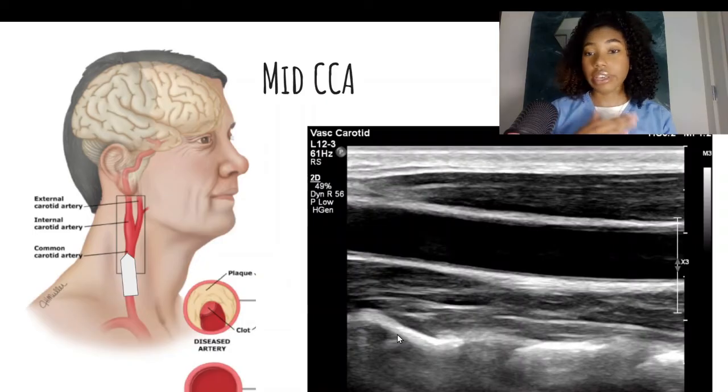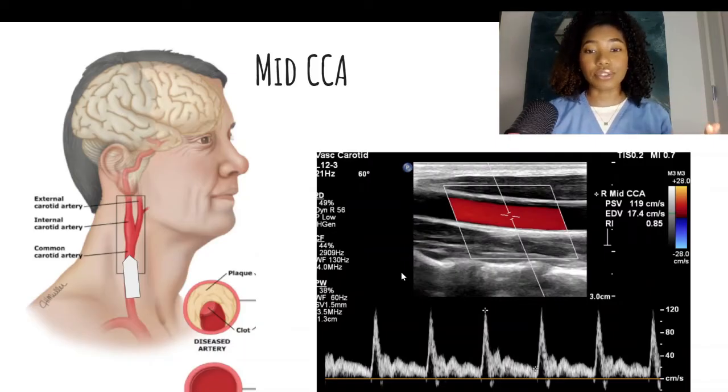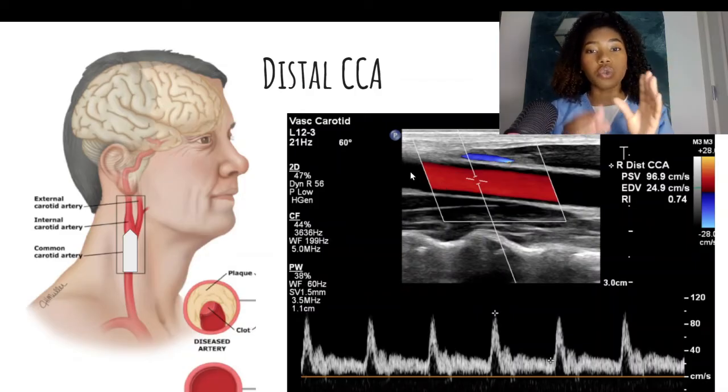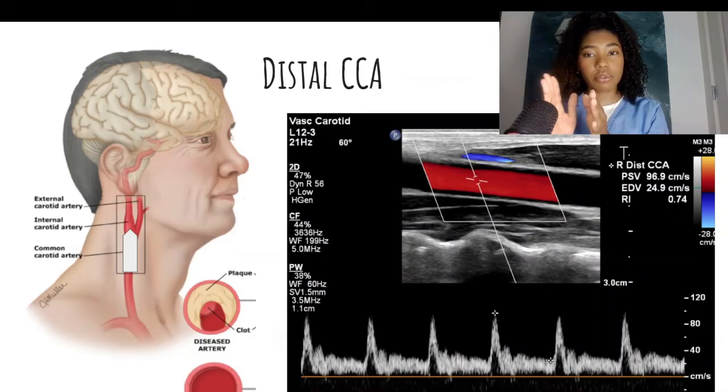Here we are going to do the exact same: image in 2D, color, and pulse wave Doppler. Then we are going to rinse and repeat at the distal common carotid artery — 2D, color, and pulse wave. When you take this pulse wave image of the distal common carotid artery, you are supposed to be a few centimeters from the actual bulb. You don't want to be in the bulb because you will have more of a mixed pattern of flow and more flow reversal. So you want to be a couple centimeters proximal to that area.